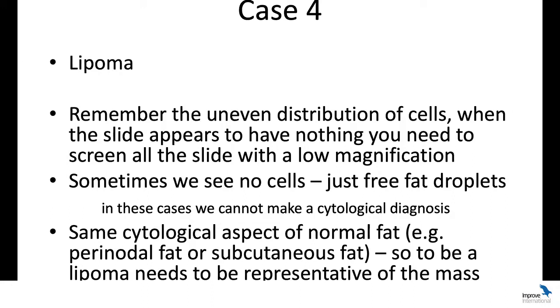Okay, Marta, we've just got one question. Yep. So how is liposarcoma different? Liposarcoma, you have a picture in your slides, handouts. Liposarcoma will look like a sarcoma. It will also have the fat, but it will have the criteria for malignancy. They're often not shy in showing us that they're evil.